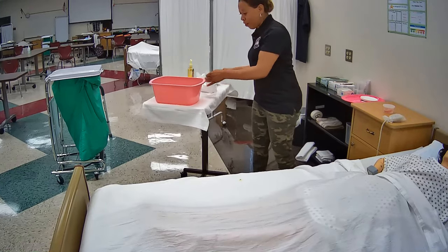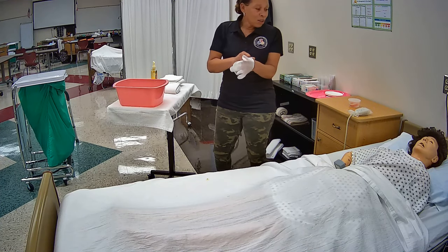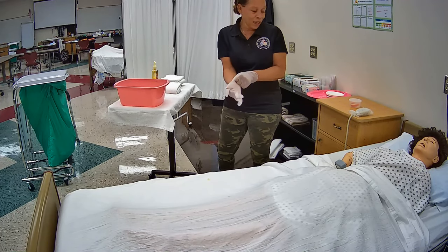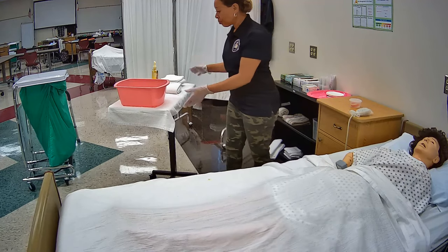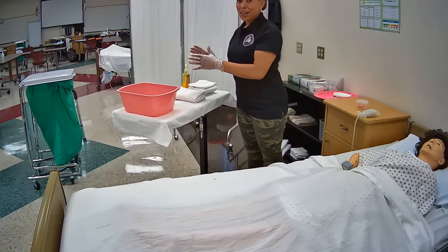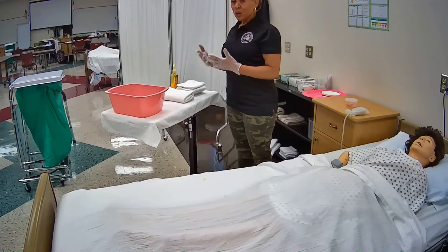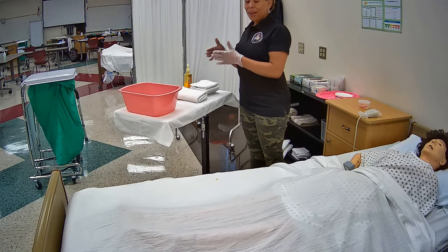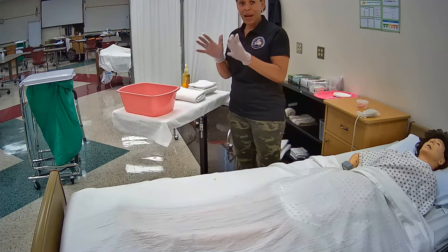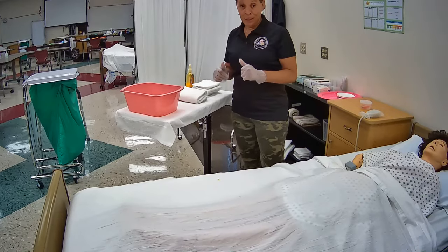The next thing I'm going to do is put on my gloves. Mrs. Jones, I'm just putting on my gloves right now, and once I get my gloves on, I'm going to place a linen protector underneath you to protect your sheets from getting wet. I have my students organize their supplies on the overbed table in the order they will use them, so this cues them as to what steps to perform next — just in case they forget, they can look and say, okay I got my gloves, so now it's time for me to put them on. I have a towel or chuck here, so now I need to place the linen protector.